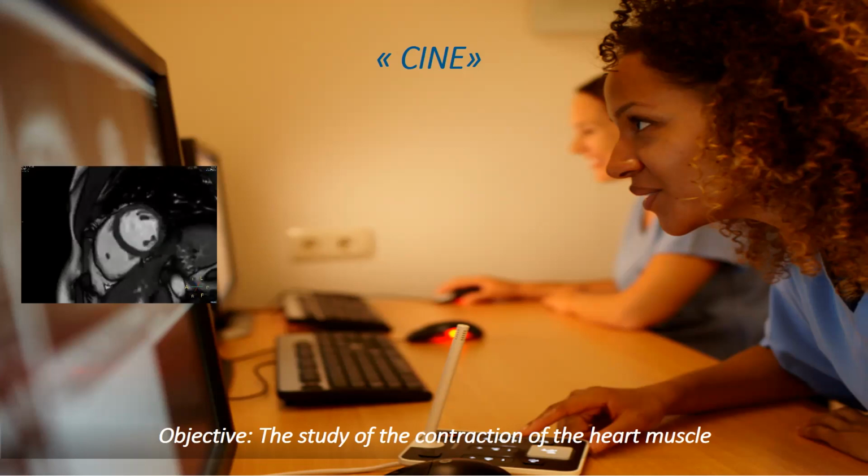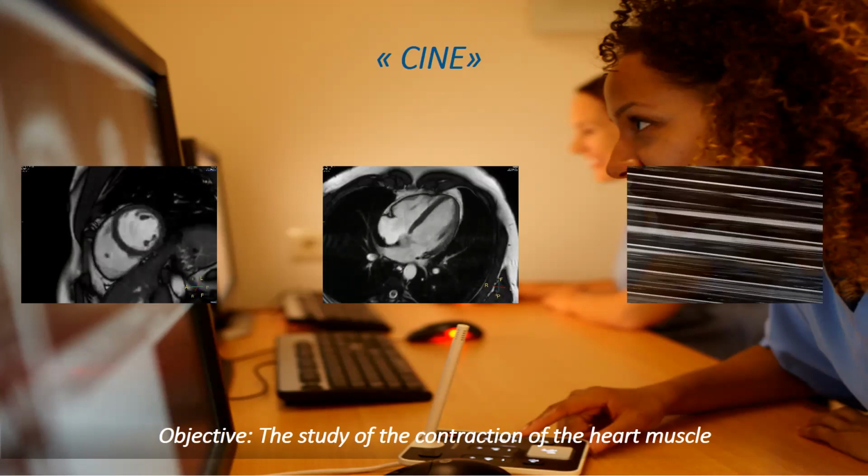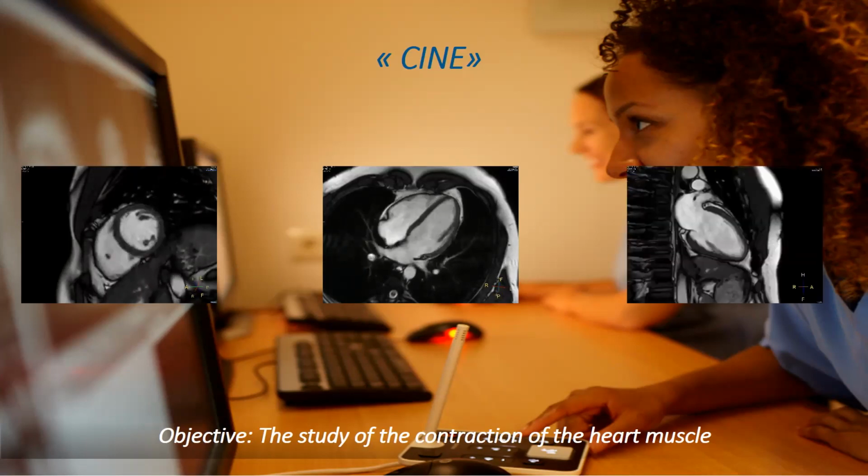Here, the CINE for the short axis, for example. Here you can see the four chambers, the right and the left ventricle, also the right and the left atrium, also the different valves, mitral valve, for example, or tricuspid or something like this. So here it's a CINE for the two chamber.